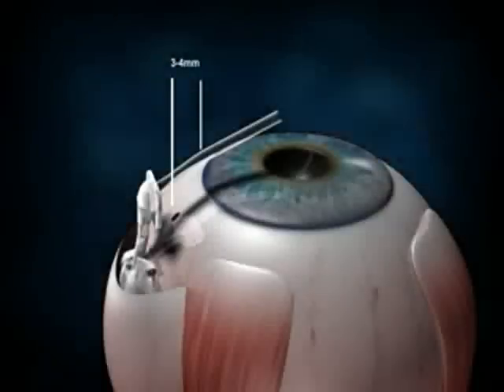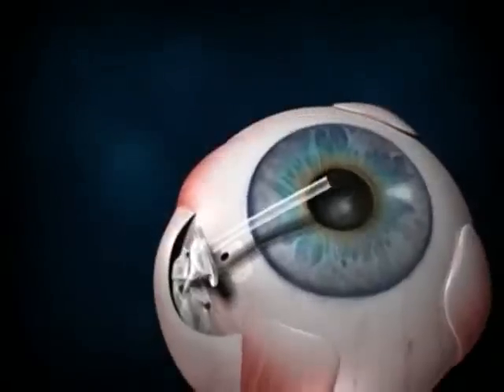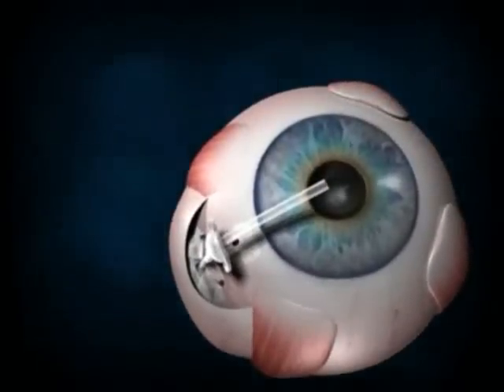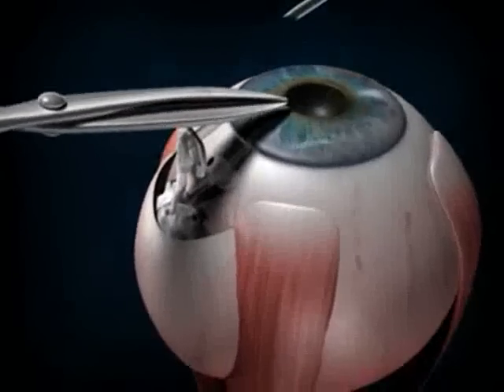Cutting the tube. Measure the tube to be 3 to 4 millimeters from the needle track. Take sharp cutting scissors and cut the tube beveled upwards. Dispose of the excess tube that has been cut off.